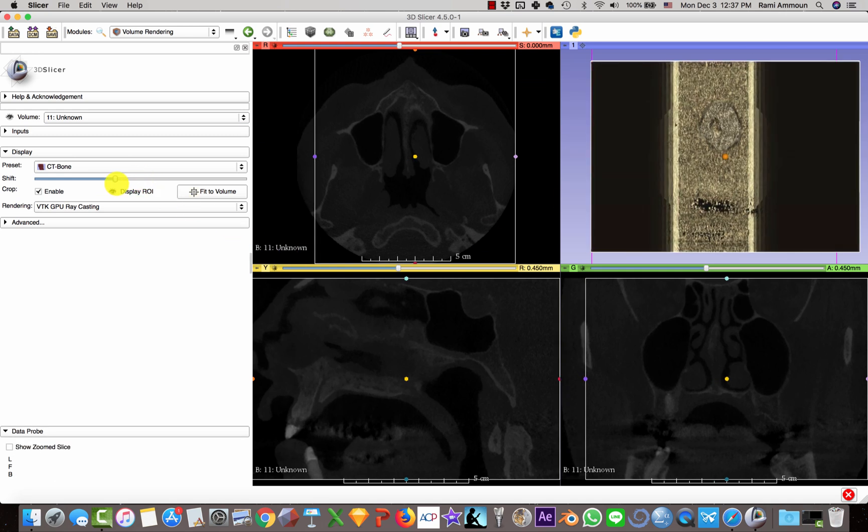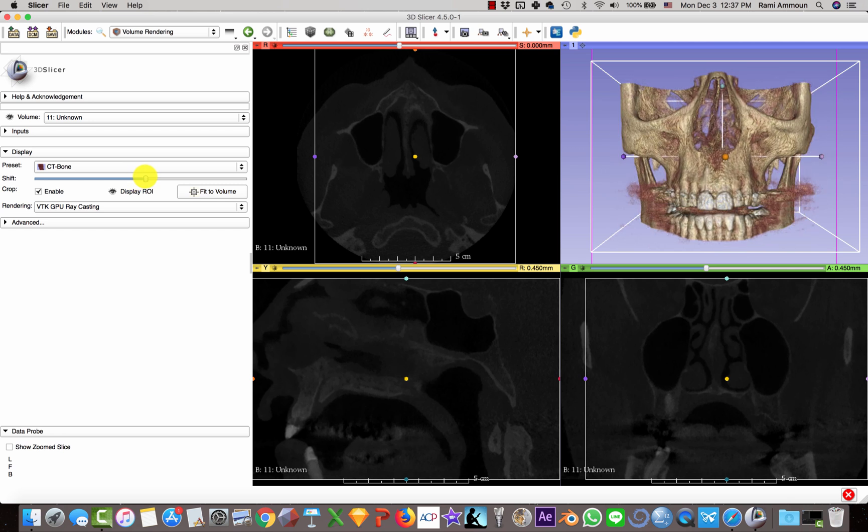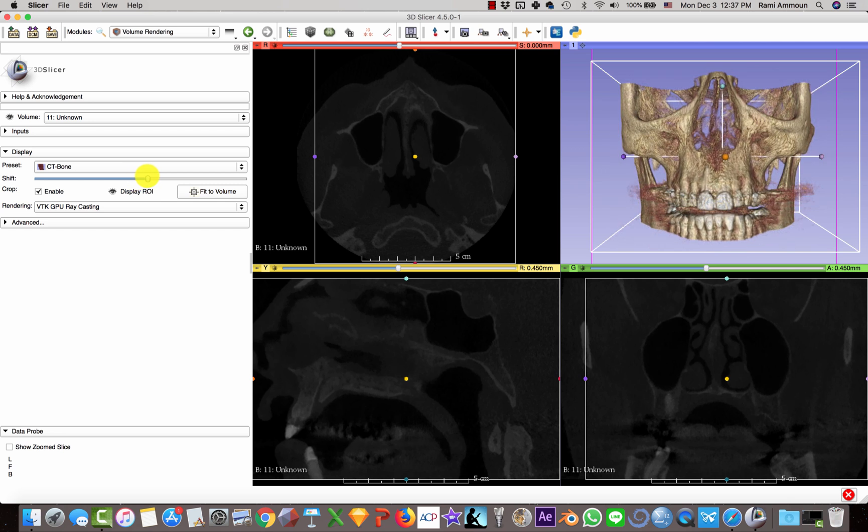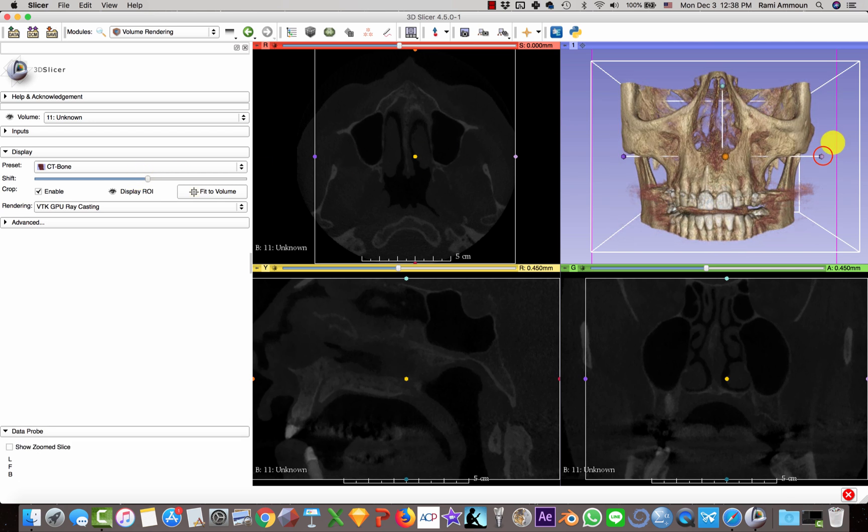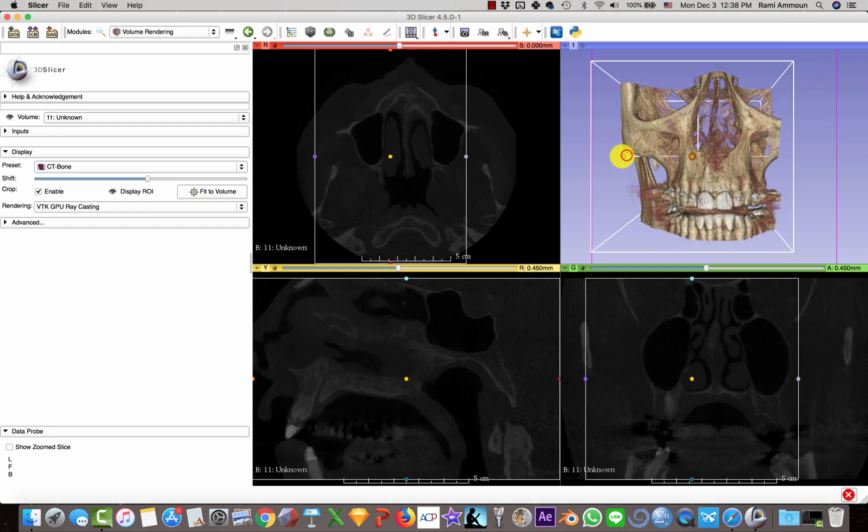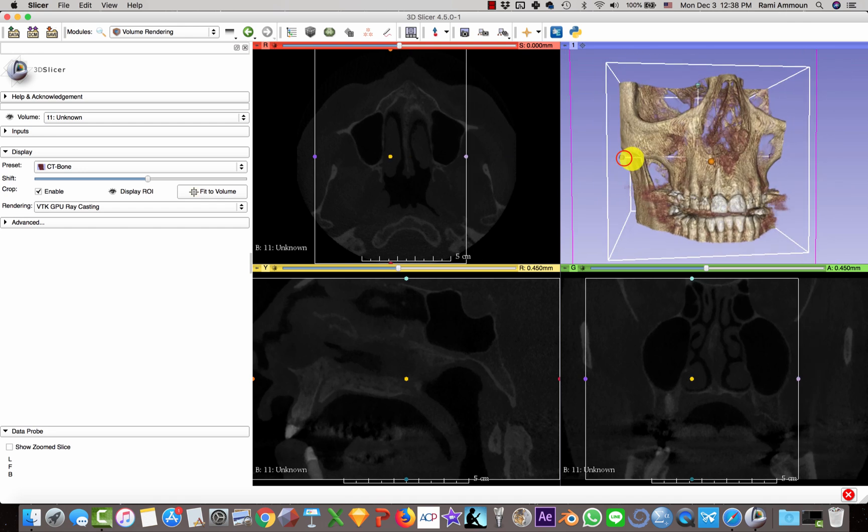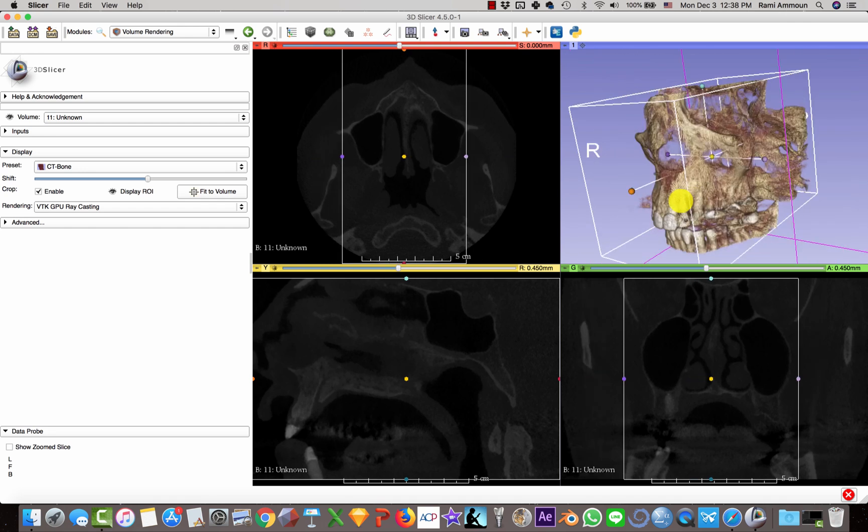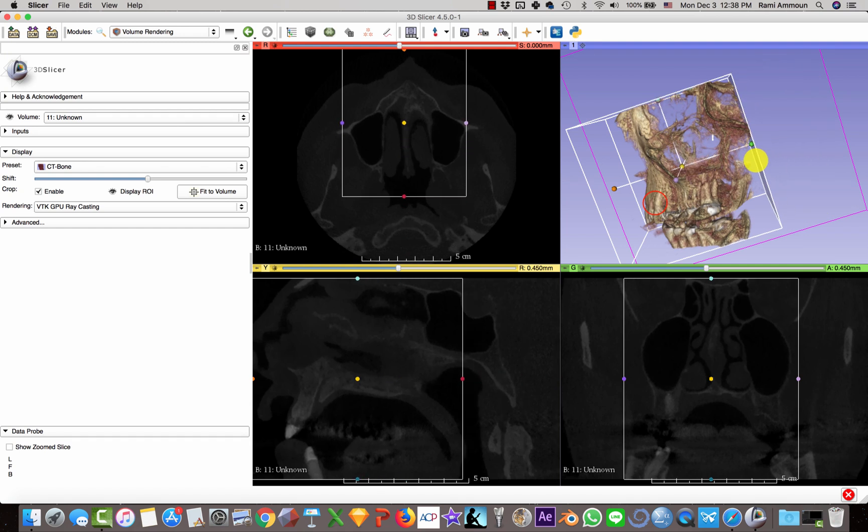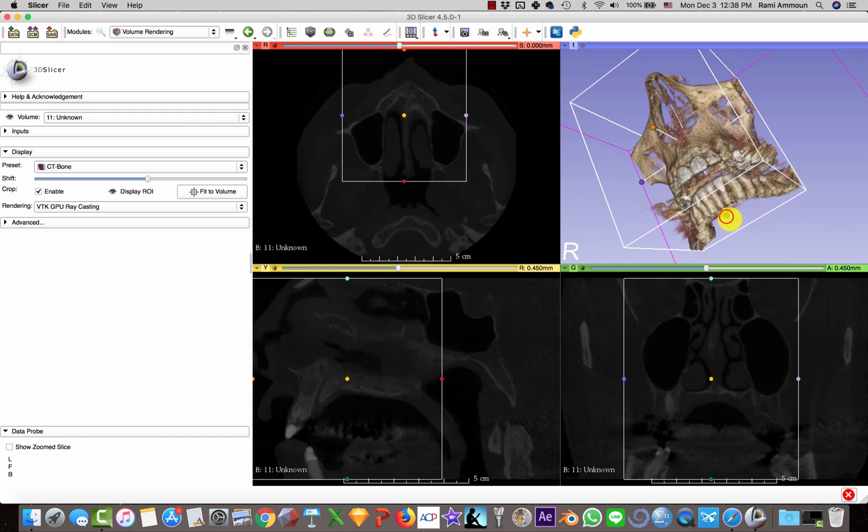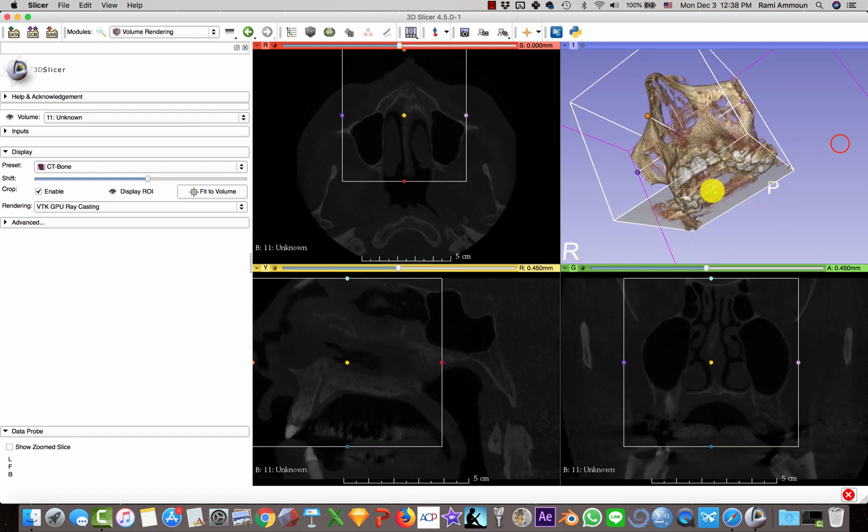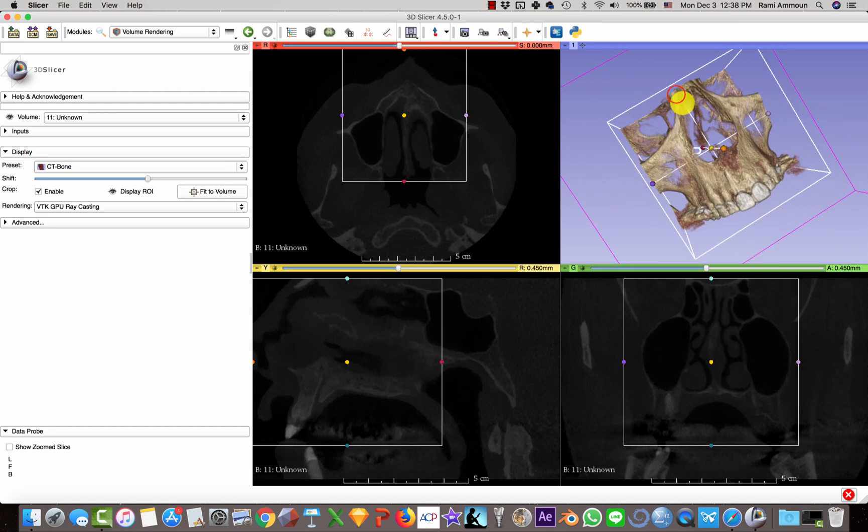Then you're going to select your region of interest. Here I am choosing my maxilla.